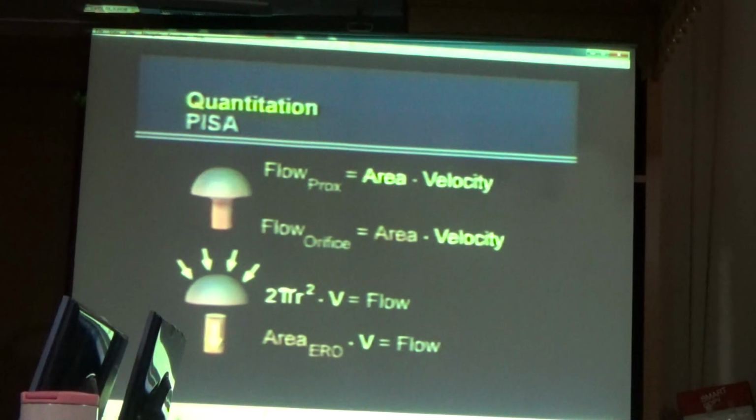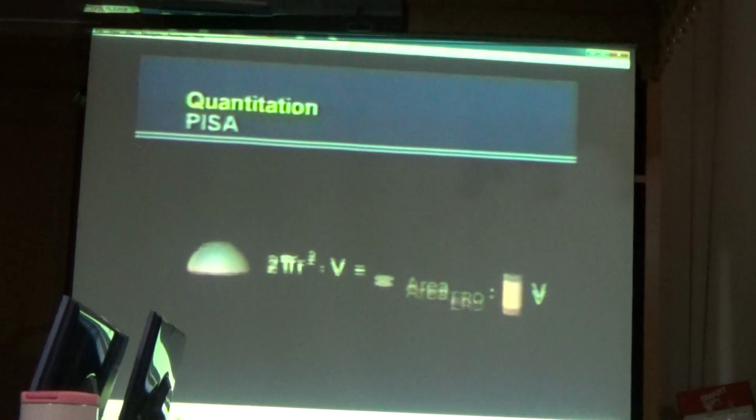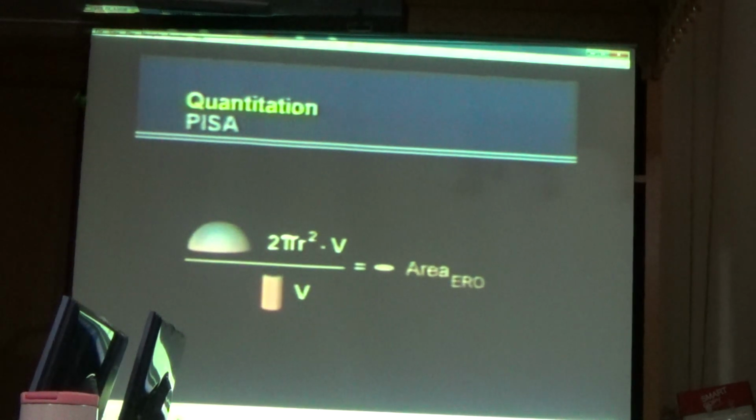So we simply rearrange the equation to make it equal to one another. Now if we want to calculate the effective regurgitant orifice, we just do a simple algebraic rearrangement of this equation and move the velocity of mitral regurgitation below the proximal flow. And we can calculate effective regurgitant orifice.